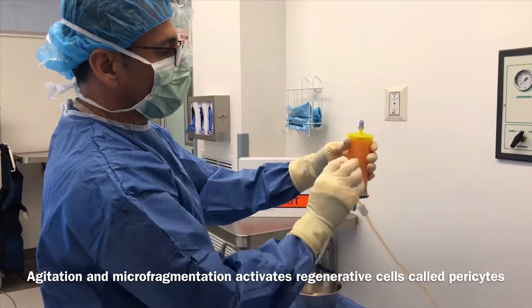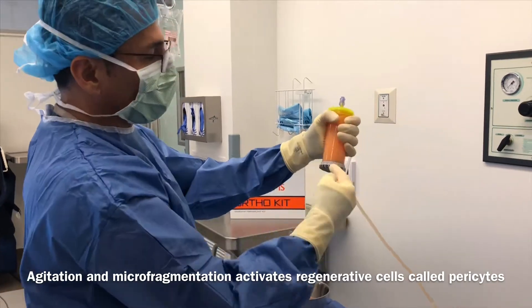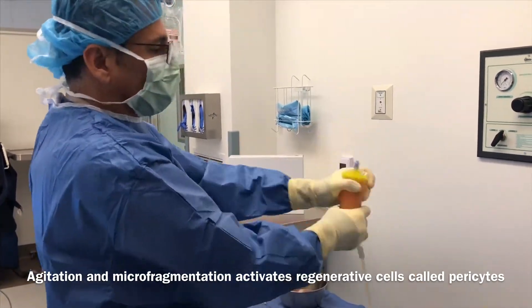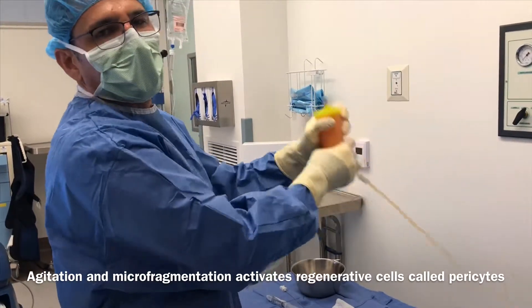Now we're going to use this canister to separate and to cleanse. In order to do that, we've got the martini shaker, and you've got to do that for a good solid minute.